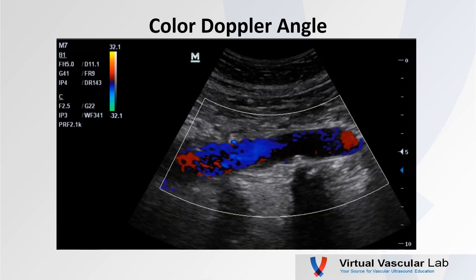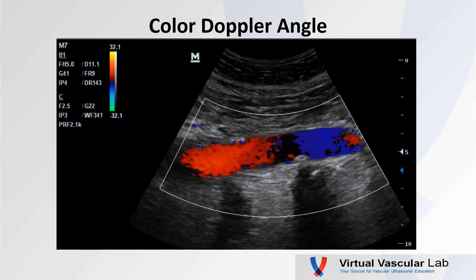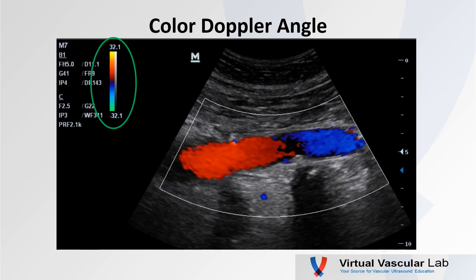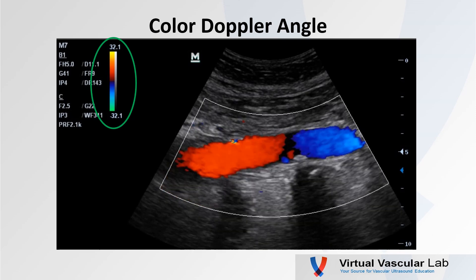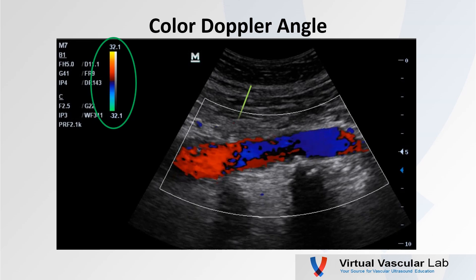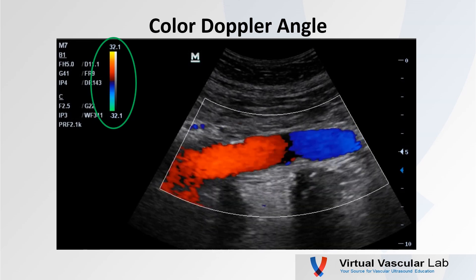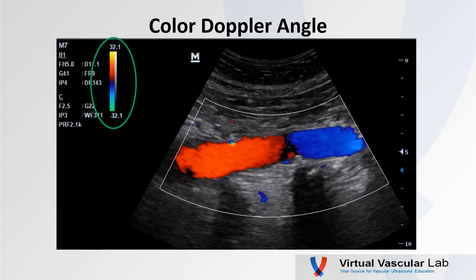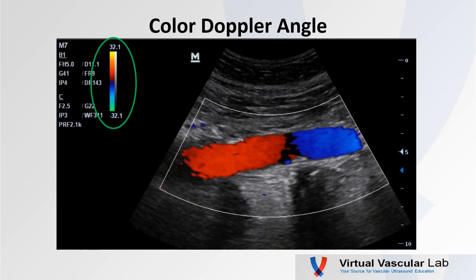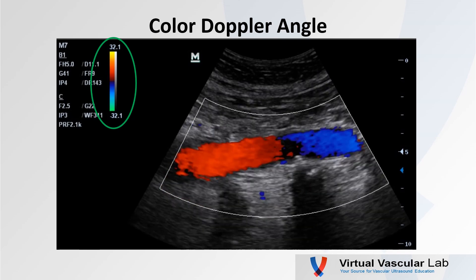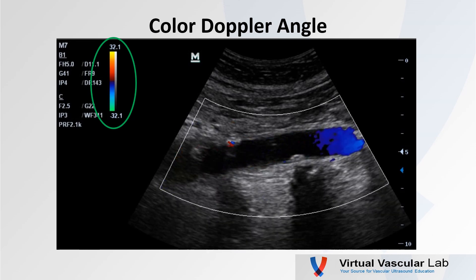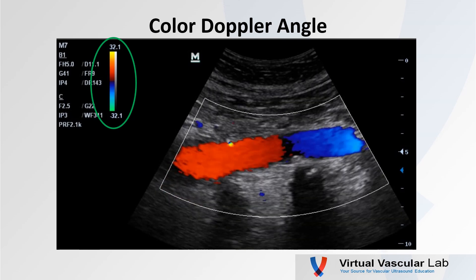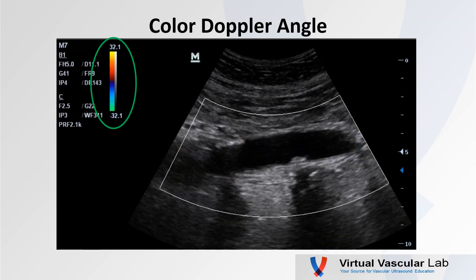Let's consider this color Doppler image of the aorta — a classic example involving changing angles of insonation. Let's check our color bar: flow towards the transducer is red, flow away is blue. On the left side of the image, where our angle of insonation comes in from this direction, we see flow towards the transducer. However, to the right of the image our angle of insonation changes, and we see blue — flow away from the transducer. So flow is moving from left to right. Right in the transition it appears almost black, because the cosine of 90 degrees is zero, giving us zero Doppler shift at a 90-degree angle of insonation.